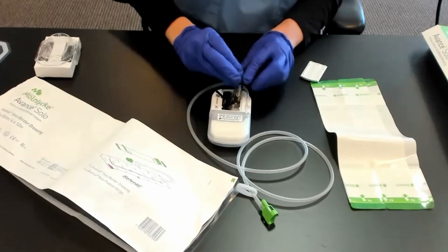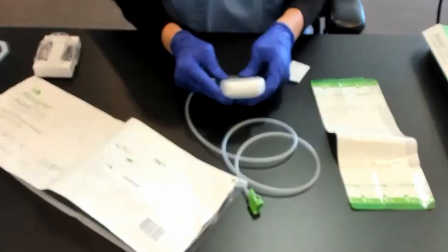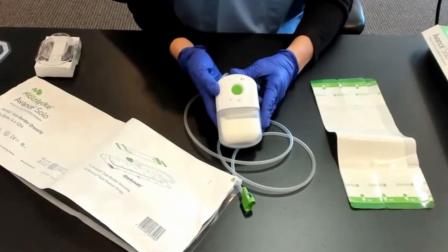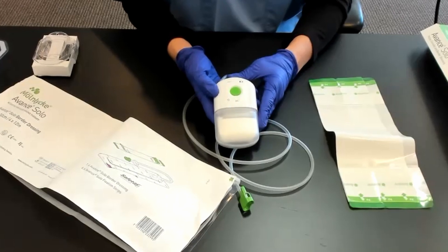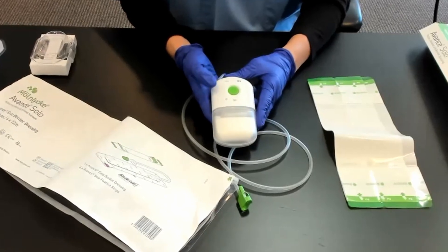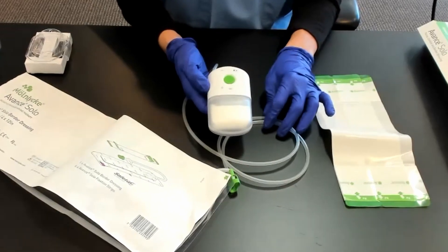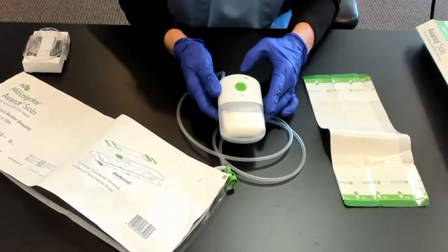The next thing you want to do is put your batteries in as the diagram shows, then put your little battery cover on. This is the self-check that you heard — it makes a funny noise and then lights will flash. Now your pump is ready to run.